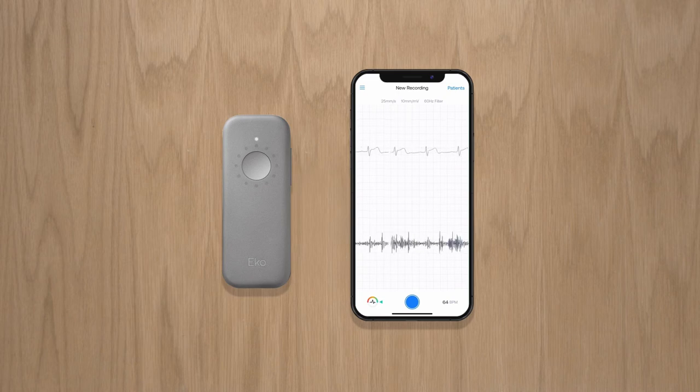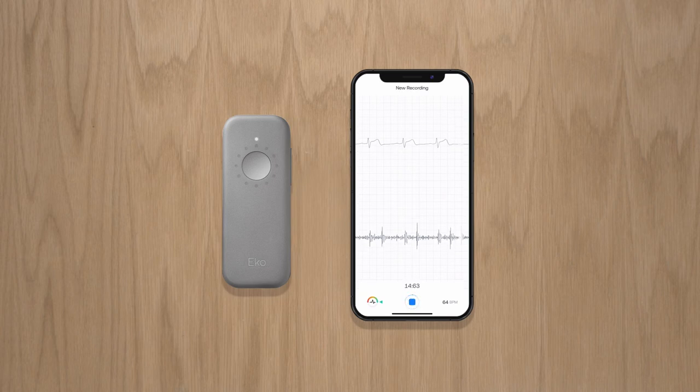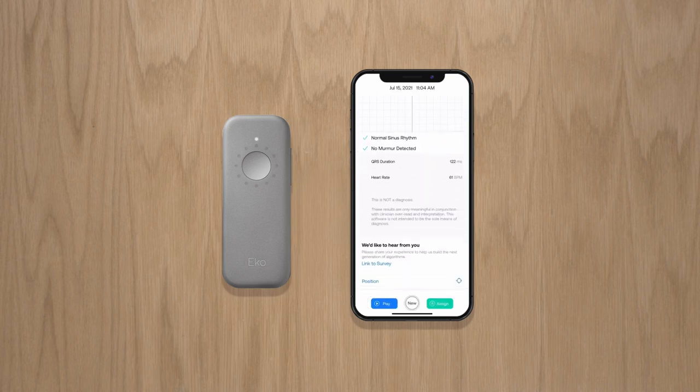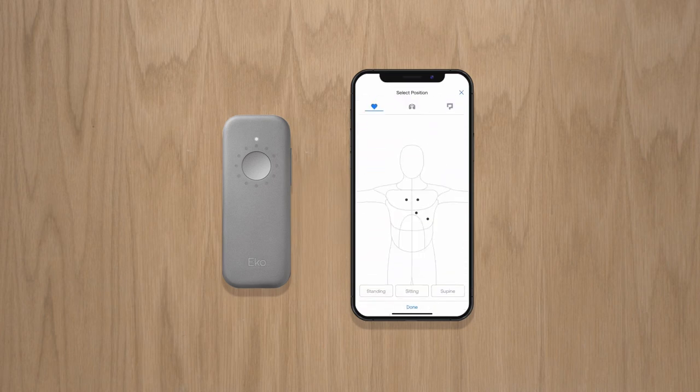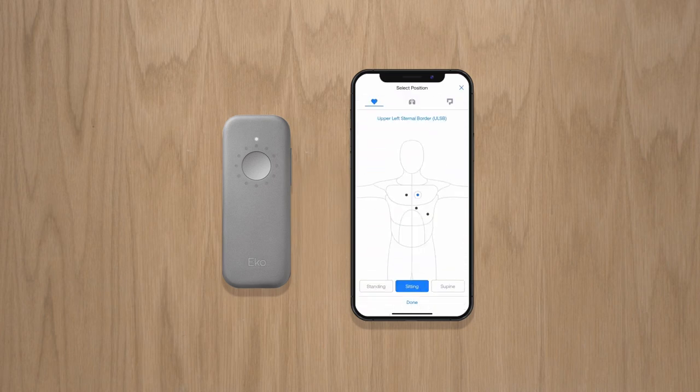When you're ready to start your recording, click the circular button at the bottom of the screen. This will start your recording. Once complete, you'll be able to review it, add notes and indicate the position. You can easily assign recordings to new or existing patients.